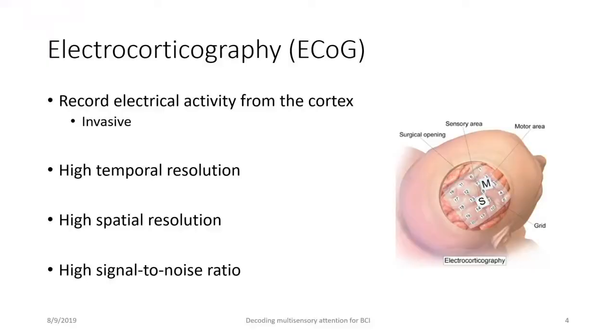And for long distance communication between the neurons or neural networks, the modality of the signal is actually electrical signal. So that's why we can measure some electrical signal along the scalp when we are having some brain activities. In order to measure electrical signal from the brain, the easiest way is to open it up. So you ask a neurosurgeon to do a surgery on you, have a craniotomy, and you place a sensor there directly onto your brain.